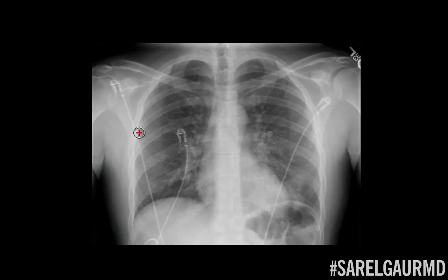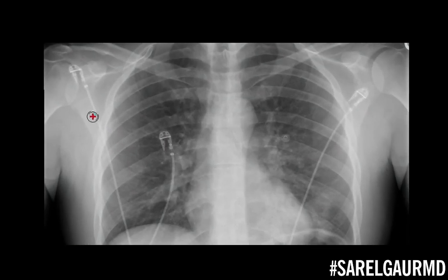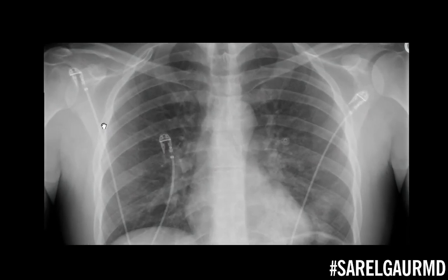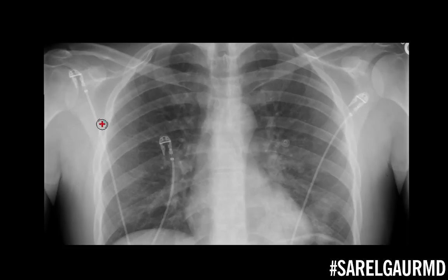Here we go, case one — cough and shortness of breath, young male. In order to understand abnormal, you first have to understand normal. These are the pulmonary vessels. You can see that they're branching as you come out to the periphery, and they're getting smaller and smaller coming out to the pleural edge here. So that's a normal finding.